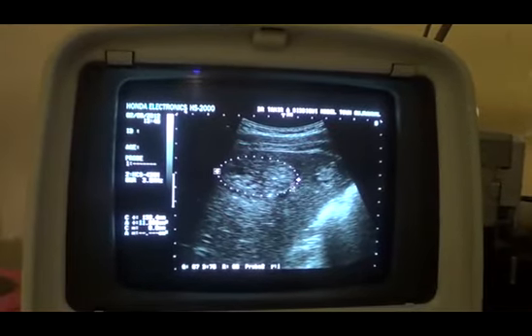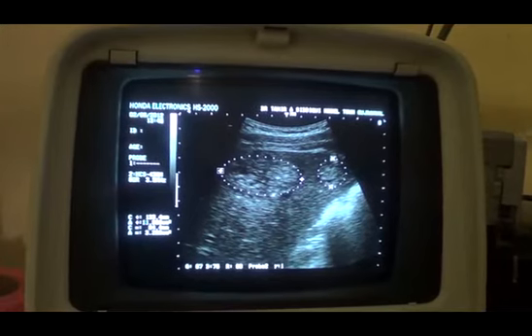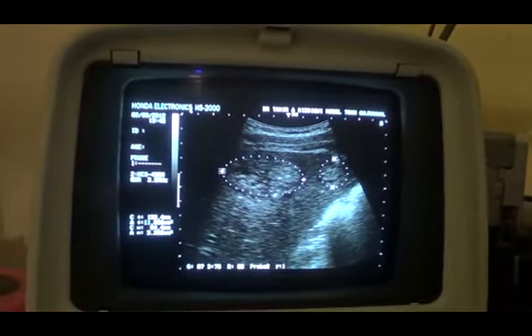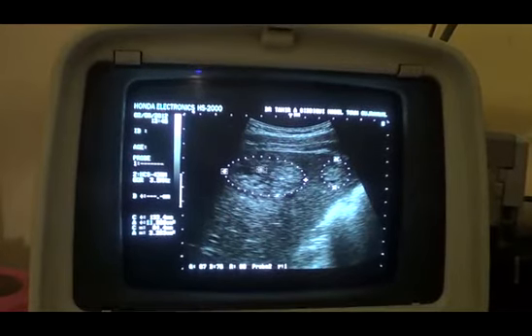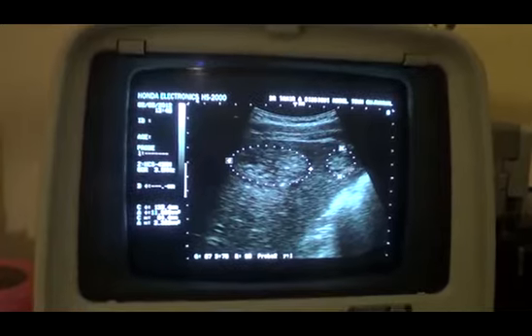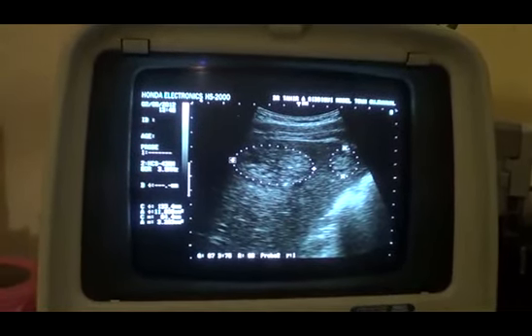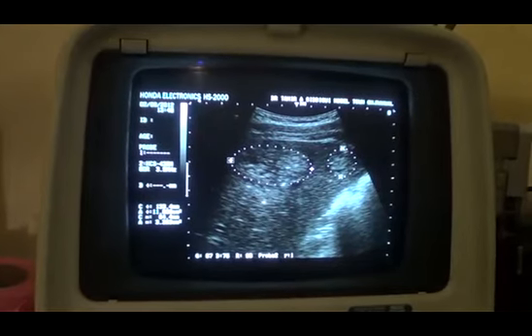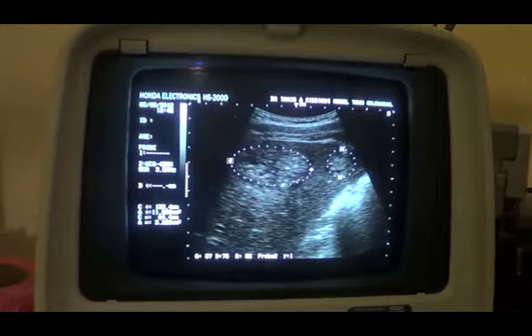This is the second one. It is lateral, that is medial to it, both having internal cystic areas, multiple internal cystic areas, and these are the echogenicity of the focal lesion itself. This is the cystic area, all this. Now there is no significant posterior acoustic enhancement or any shadowing posterior to both of these.